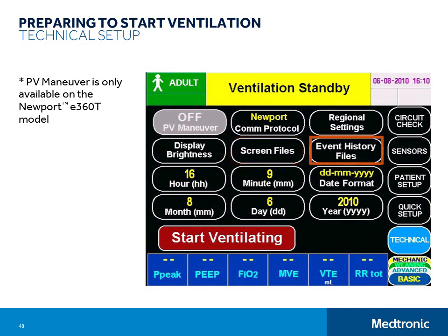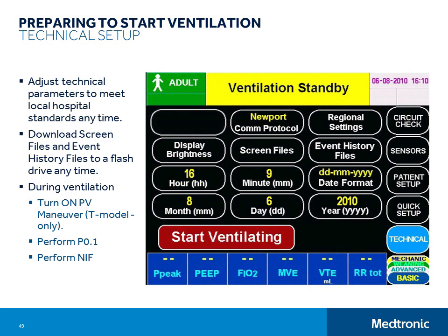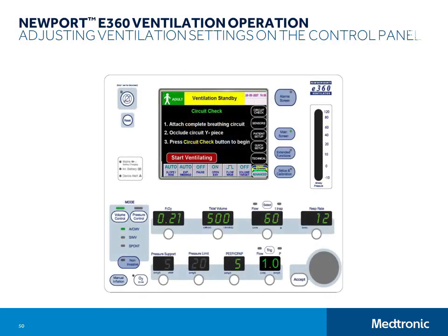After your first setup, you will only visit this screen to adjust screen brightness, download image or event history files to a flash drive, and if you are using the T-model, to turn on the PV maneuver function. You can adjust technical settings and download files at any time during standby or while ventilating, but you must be ventilating in order to turn on the PV maneuver. To exit this screen, you just need to touch the Data Sets button in the lower right-hand corner or press a Control Panel menu button. Now we'll go through the basics of manually selecting ventilation settings. Remember that you can touch the Start Ventilating button at any time to start ventilation.